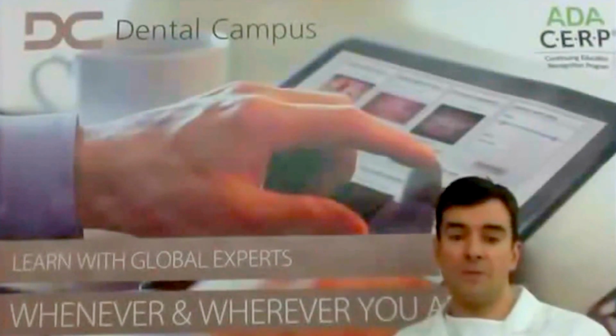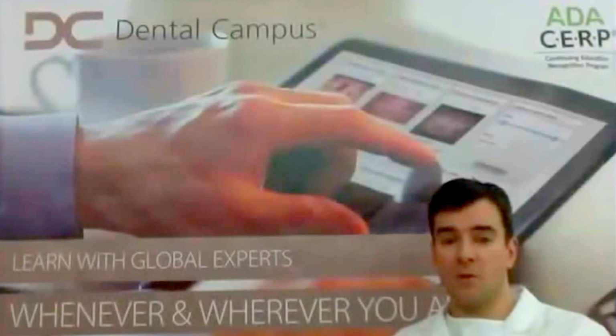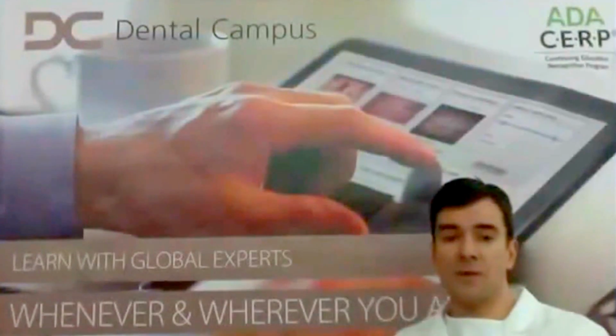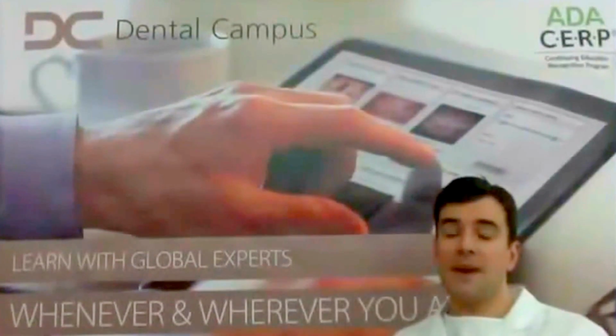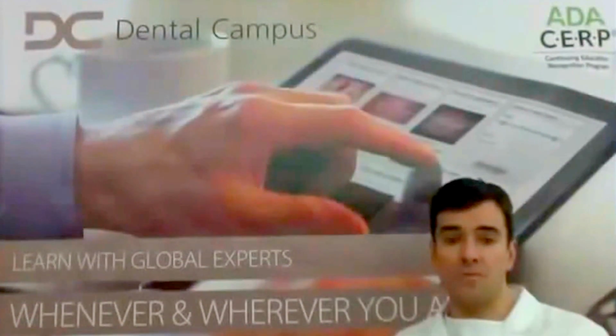So what happens with small dehiscences? There is a minor amount of rough implant surface which is not covered. So possibly there is no influence on the implant survival and success. However, on the other side, there might be an increased risk of periimplantitis. So we don't know.